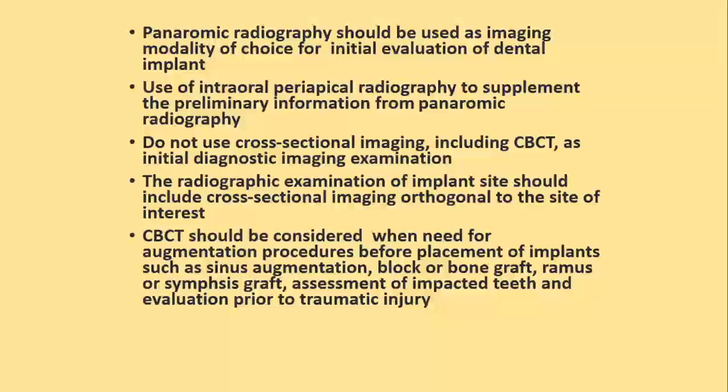Is this patient meant for an implant? It's not the end, once you get a CBCT, yeah, my job is done. It's not. The reason you're sending for CBCT is to plan your implant, and that planning would start with a PAN, because it's telling you the status of bone around.